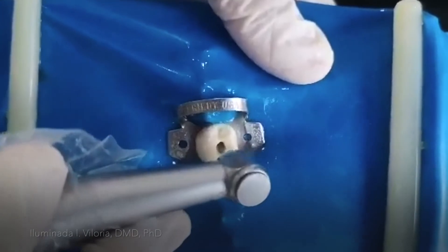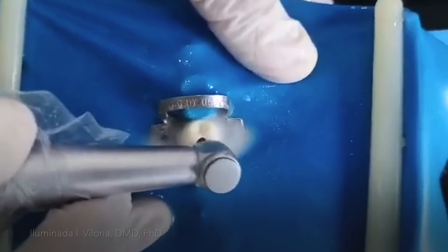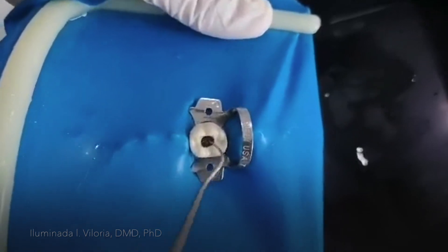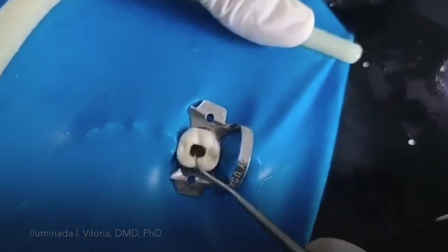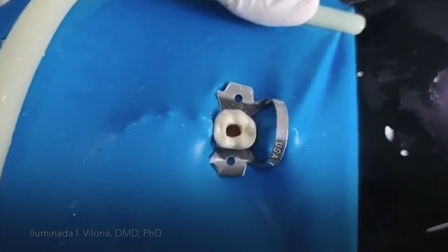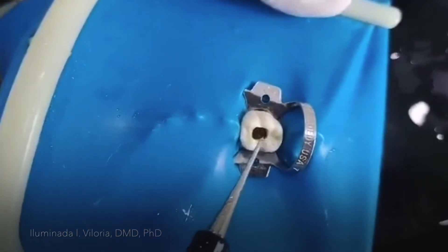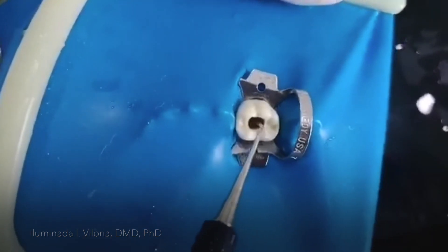My burr is directed towards the orifice. Try to feel if there is still any touch on all the walls. Look for the canal orifice first using your endodontic explorer. Once you have located it, you can feel the touch.